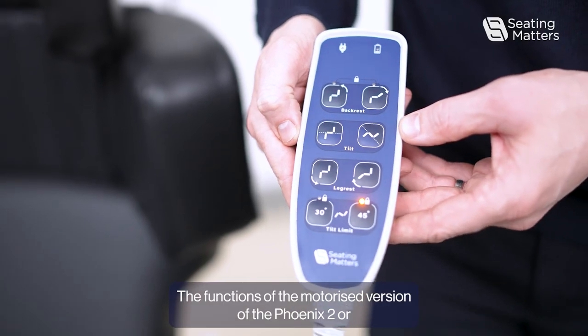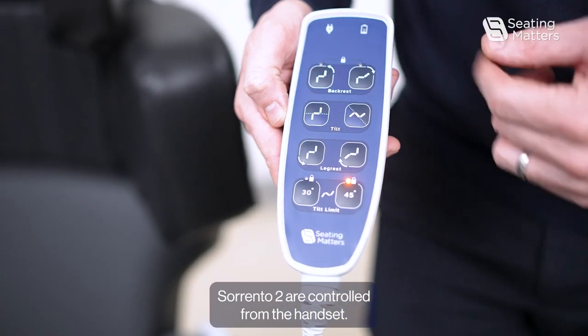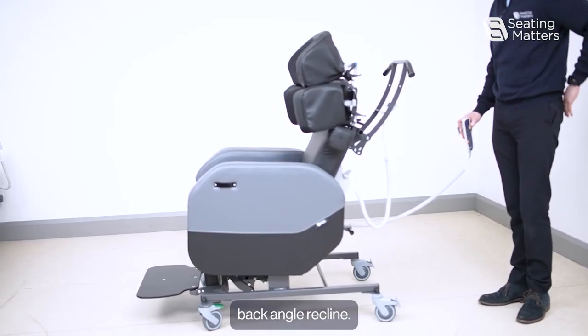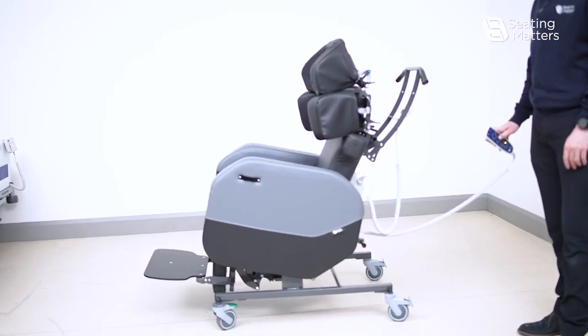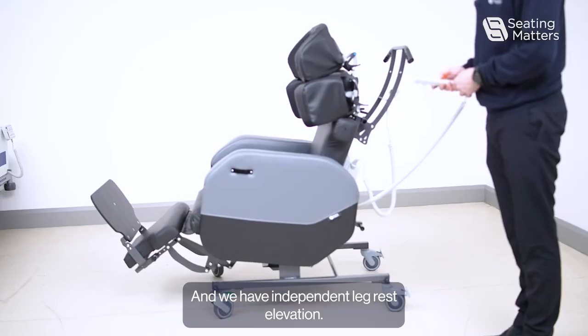The functions of the motorized version of the Fenix 2 or Sorrento 2 are controlled from the handset. On the handset we have independent back angle recline, we have independent tilt in space, and we have independent leg rest elevation.